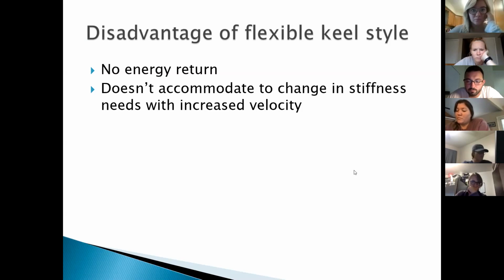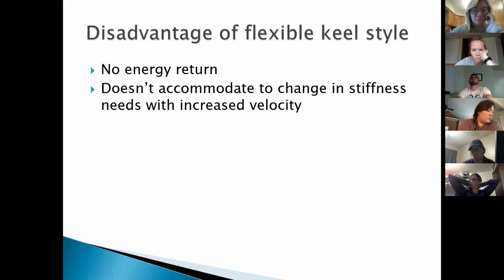Anyway, so do you remember as she got stronger and she got better with walking, what we would see is that as she would go into terminal stance, she would have an exaggerated dorsiflexion angle on the prosthetic side. And that is because as she was walking faster, she's generating more external dorsiflexion torque.